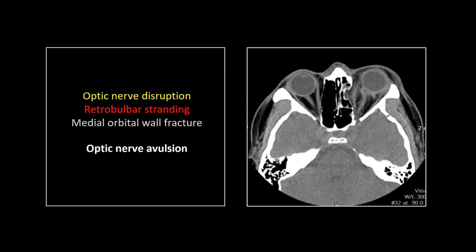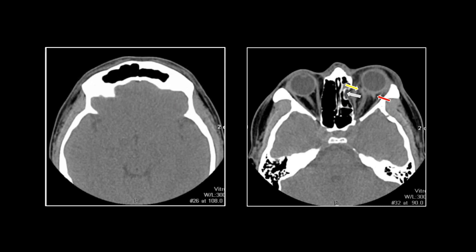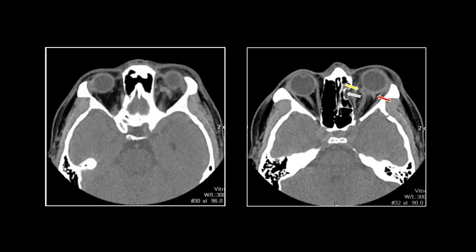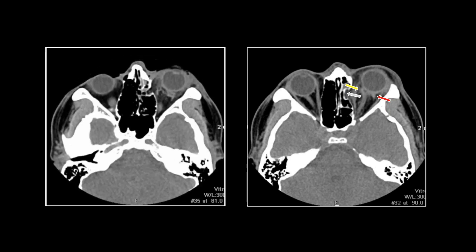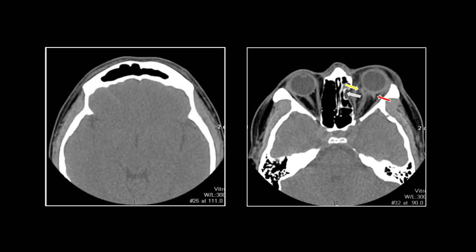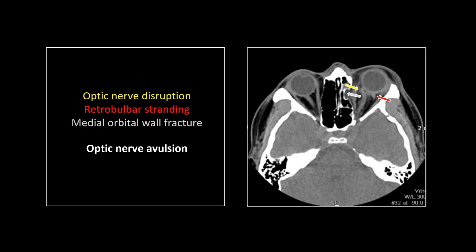This is an incredible case — a ruptured, avulsed optic nerve. You can see it is no longer syncing up with the back of the eyeball as it should. There's also significant retrobulbar stranding and a little medial orbital wall fracture as well. You can see the optic nerve just doesn't attach to the back of the globe any longer. This one was an embarrassment — a radiologist saw this, called the retrobulbar stranding, called the fracture, but did not call the optic nerve. The clinical history said loss of vision left eye. So there's no excuse for missing that one. It's an unusual injury, but even the clinical history was on your side.